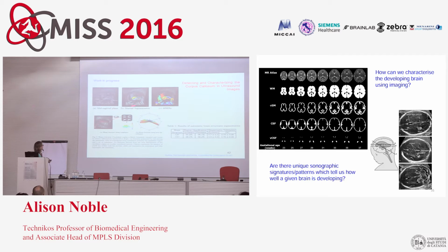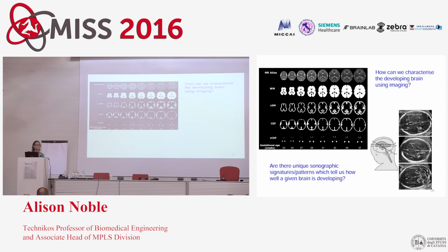But the goal is to extract a structure in very, very complicated sonographic patterns. But if you've got some examples of these, you actually start to learn what the characteristic context patterns are. We use the MSERs, which allows you to characterize approximate shape and then characterize intensity patterns around that, and are starting to get, in terms of region classification, some quite accurate results at determining the corpus callosum and the related structure shown there.